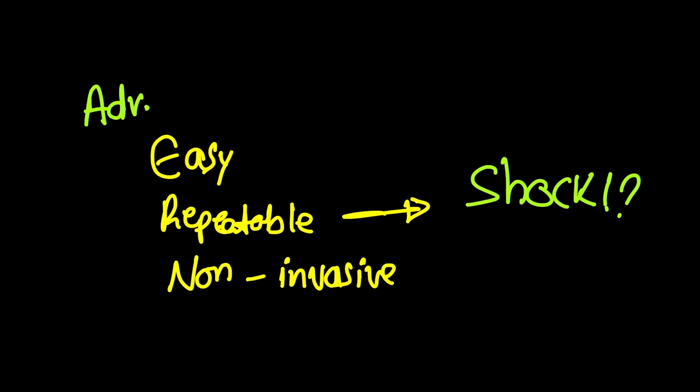It's an easy, repeatable, non-invasive way to check the contractility of the left ventricle and to be able to identify and classify the cause of shock in your patient.